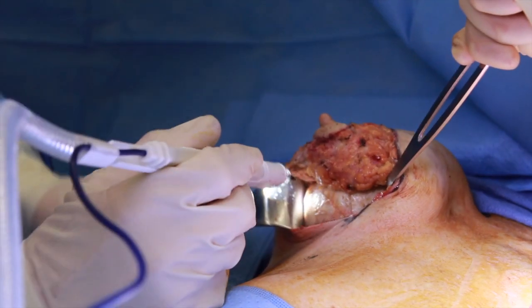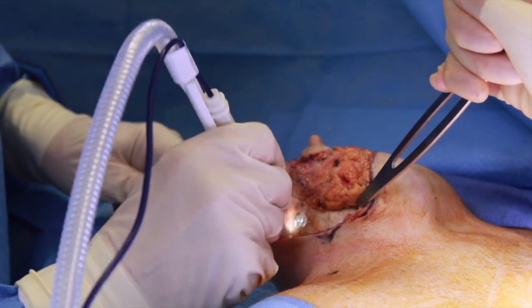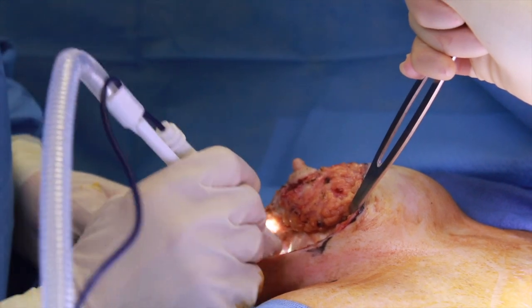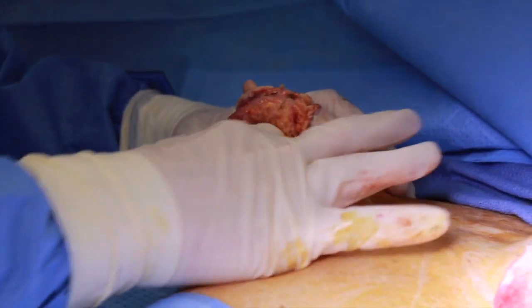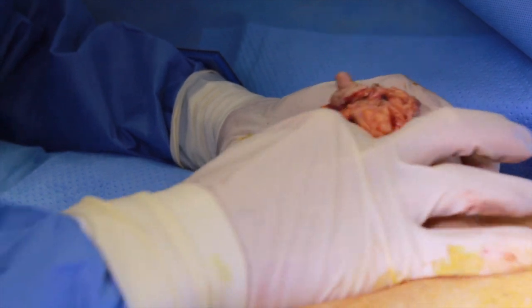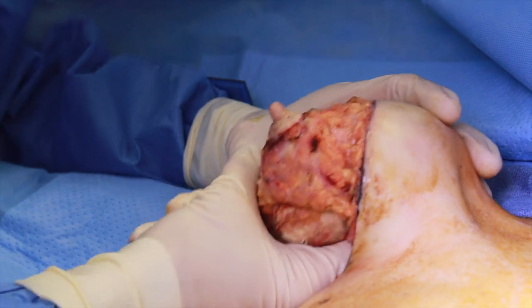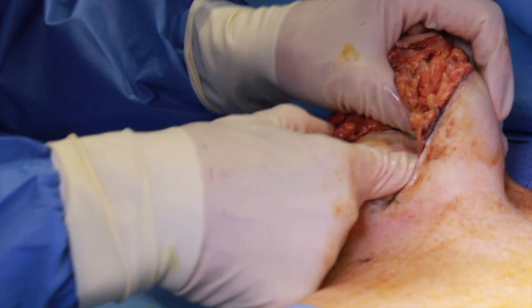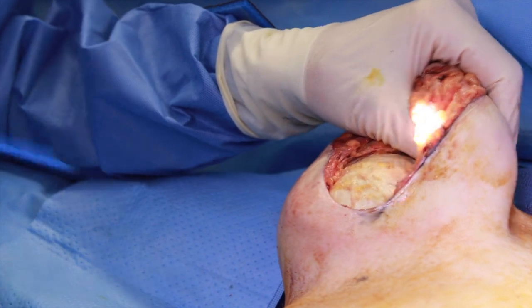You can see how difficult this dissection is because we're trying not to get into the implant. This is called an en bloc excision of the capsule. I'm going to do a little blunt dissection with my finger as far as it goes, then get to some firm areas and go back to cutting. The important thing is I haven't gotten into this capsule — if you do, it makes an enormous mess and it takes a couple of hours just to clean that up.